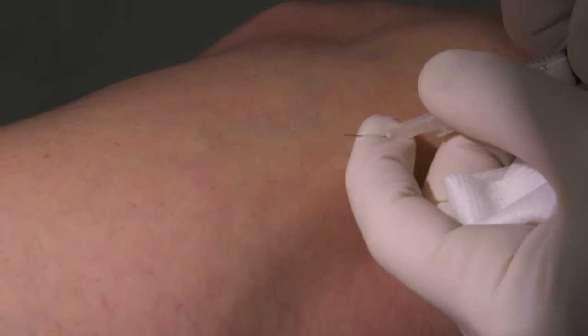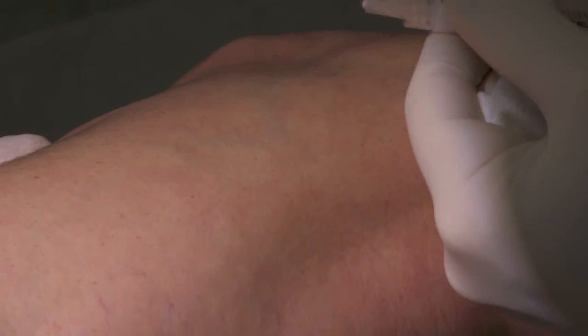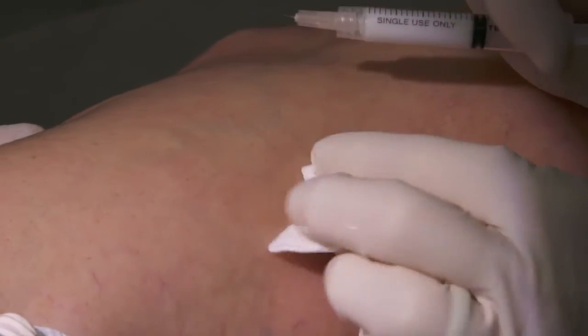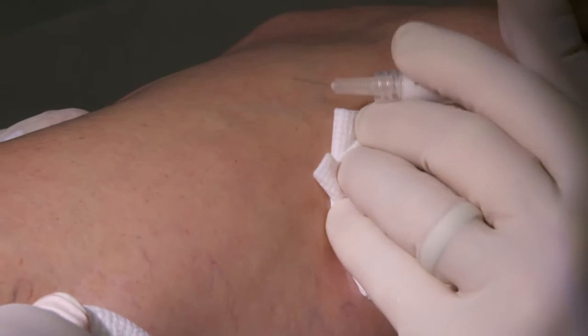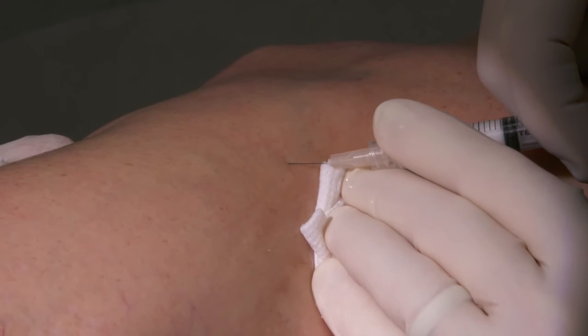So we're using a really small needle and I don't think you're gonna feel much discomfort at all with this. You let us know. And we're gonna be injecting a detergent solution — this is what we call foam sclerotherapy. And that's what we use on the bigger reticular vein. On three, you're gonna feel the needle. One, two, three — needle.